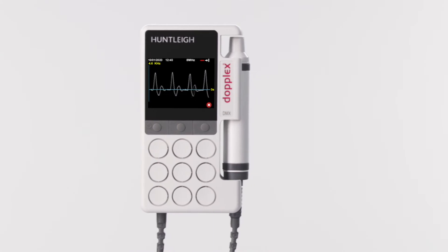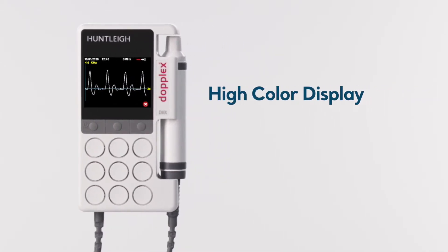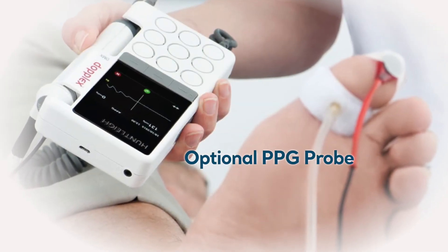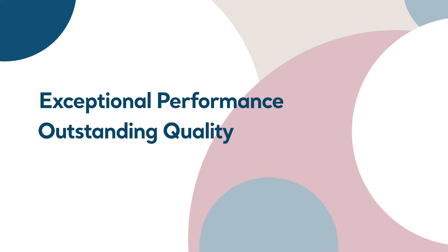The DMX Doppler introduces two new innovations: a new high-color waveform display, and as an option, a PPG probe with an assisted deflation system for measuring the toe brachial index more easily than ever before, all while continuing the Huntley tradition of exceptional performance and outstanding quality.